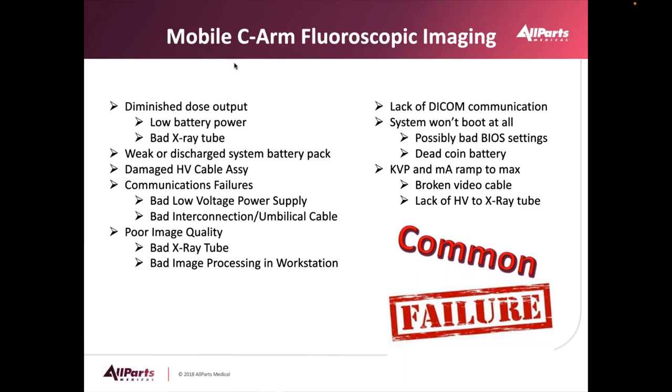System won't boot, possibly bad BIOS settings or a dead coin battery. KV and MA ramps to max. Well, the system can't see any x-ray. So there's probably a broken video cable, or we have a lack of high voltage to the x-ray tube.